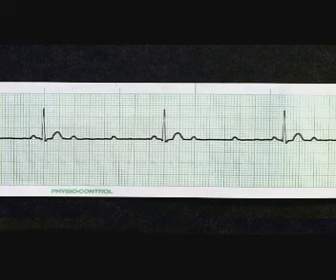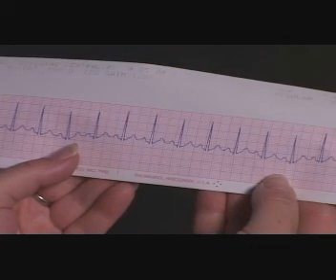Small marks across the top of the ECG paper measure 3-second intervals. These are useful for quick estimations of cardiac rate. Moving vertically, each small square represents 1 millimeter, and each large square represents 5 millimeters of voltage. In reality, voltage is measured in millivolts, with 1 millivolt represented by 10 millimeters on an ECG tracing. In clinical practice, however, waveforms are described as having, for example, 3 millimeters of height or depth.